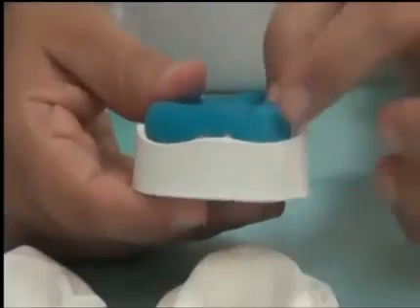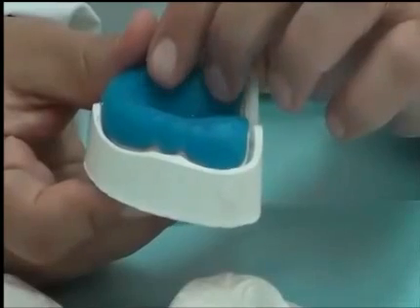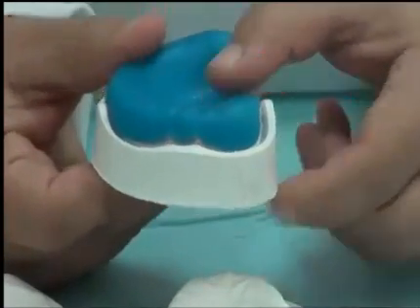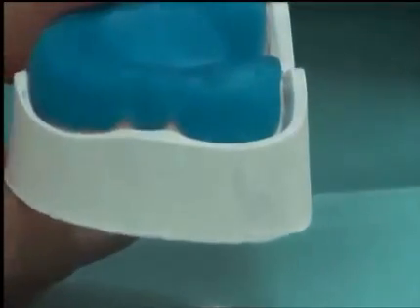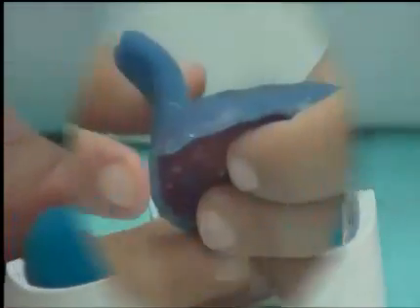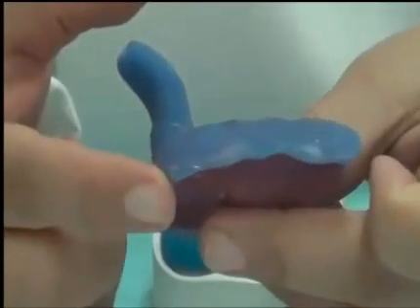So to perfect border molding, which is adding green stick to these borders, we need to make sure that we have space for the border molding material. How do we create space? By making our tray short from the sulcus. The tray is not in the full depth of the sulcus. The tray is short from the sulcus by around 2 to 3 millimeters. This allows a space for the green stick to be placed inside the mouth later on. So, the outline of the tray will be away from the sulcus. So, the border all around will be short from the sulcus by 2 millimeters.